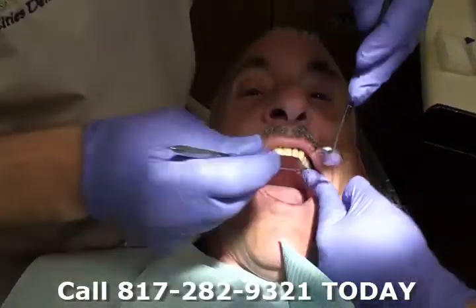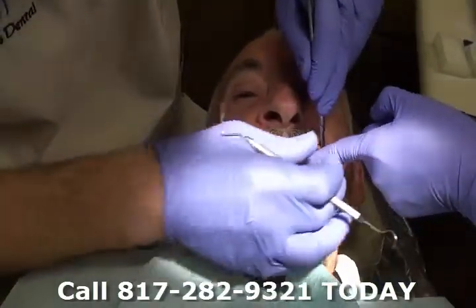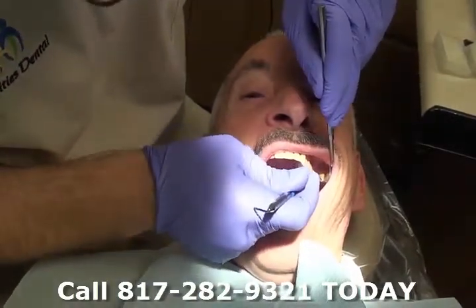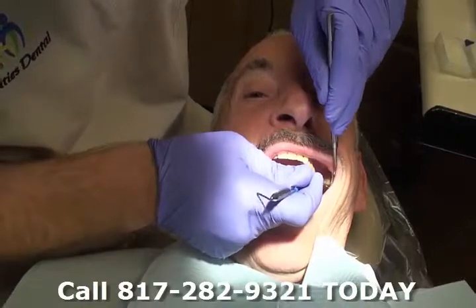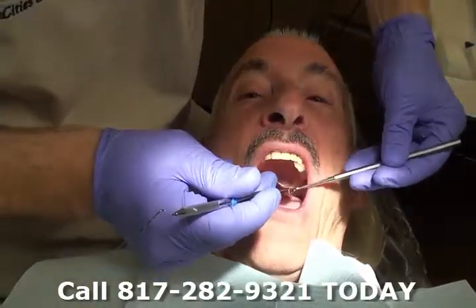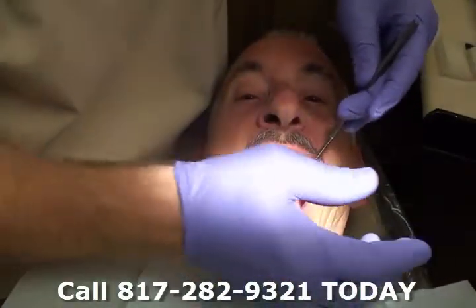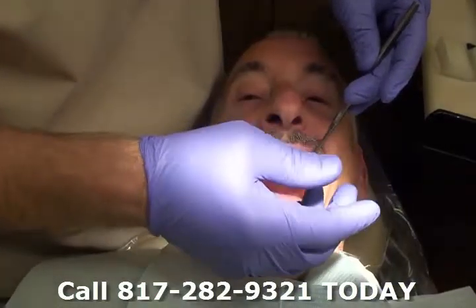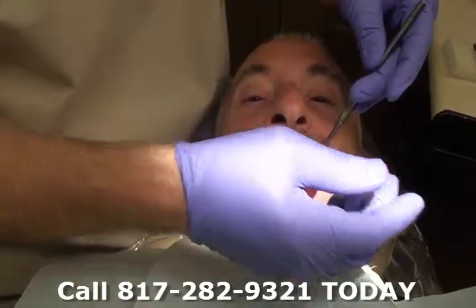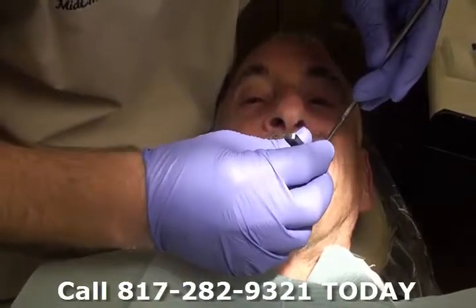That feels good. I'm going to get right by your thumb. Let me get the paper. I'm going to have you bite down on this for just a little bit. Go ahead and tap your teeth together in several spots.